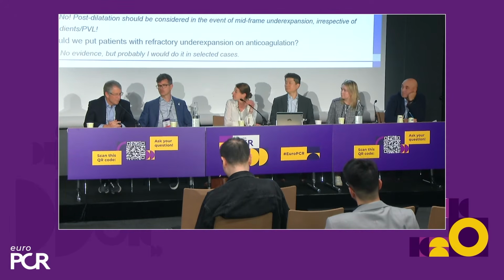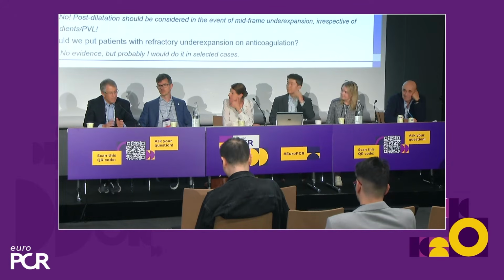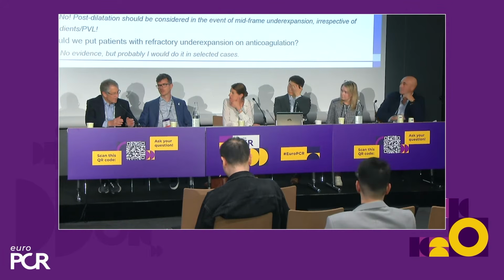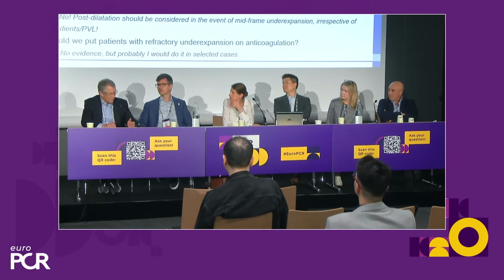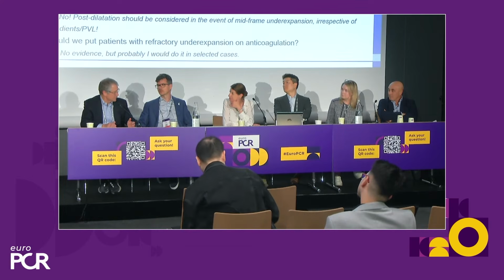Well, we do hemodynamics and echoes on everybody. I can't implant Accurate right now because of the U.S., but I do want to make one comment about the difference between Europe and the U.S. You have to look at how these trials in the U.S. were performed. The two original randomized trials, Edwards and Medtronic, we started with high and extreme risk. We had years to learn how to use the valve and improve the valve. Then we went to intermediate risk, and we had years to learn how to use the valve and improve the valve. And then we moved to low risk. And all of a sudden we come here and we take a valve that nobody in the U.S. has ever used and compare it against valves that we've been using for years.